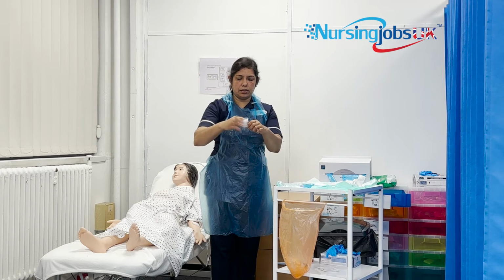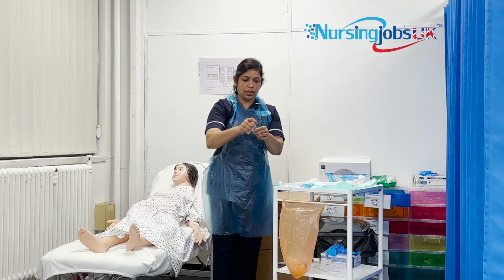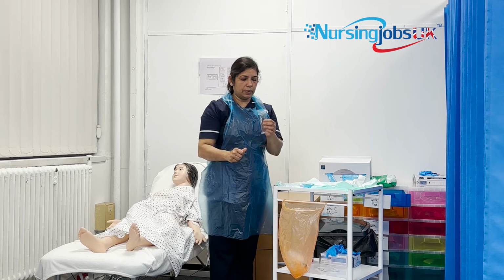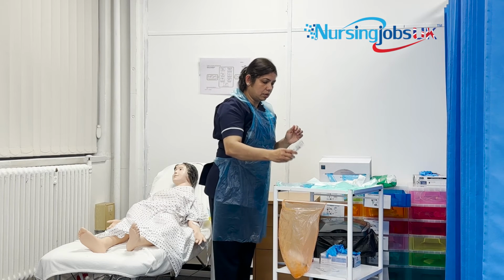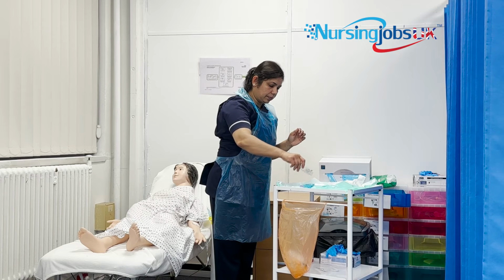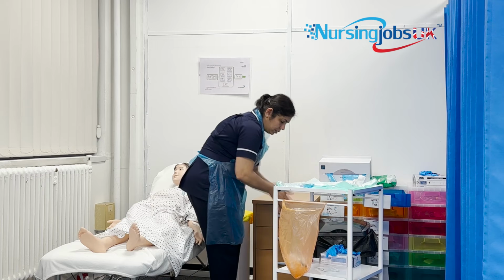So open it, clean for 30 seconds, 28, 29, 30, and wait for another 30 seconds to dry. So now it's dry, 28, 29, 30. So open it, now you need to pour it very carefully without touching and without splashing. Gel the hands again.